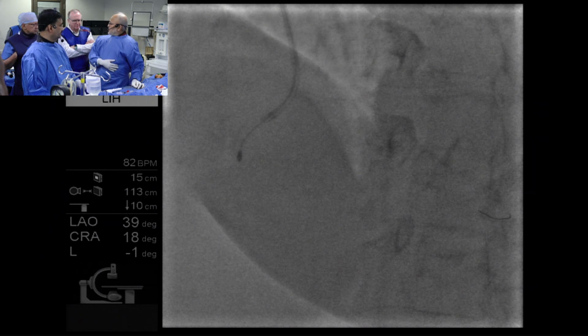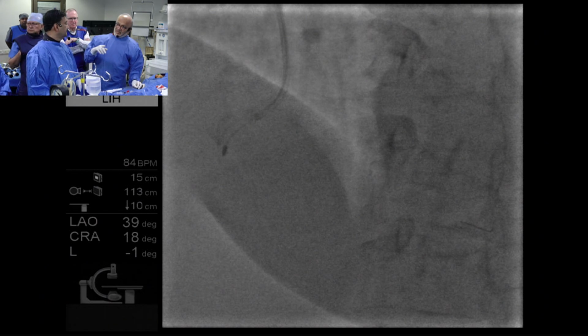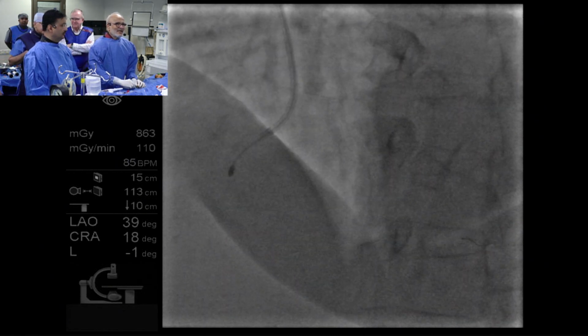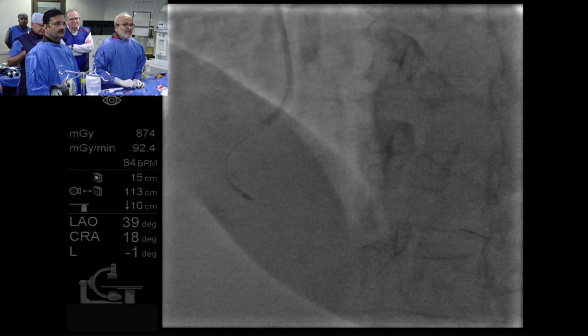150,000. I think the Japanese way of doing rota, professor, is a bit different, like 170, 180, or maybe 200,000 RPM, right? Yeah. But each depends. We are a little scared in these arteries. It is RCA. Go. Use Dynaglide? Yeah, Dynaglide on. Rajiv, we are going ahead with Dynaglide.